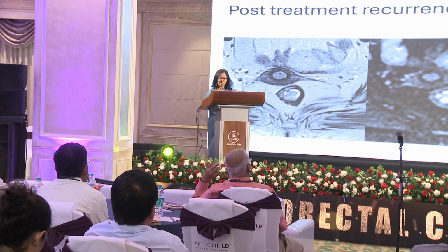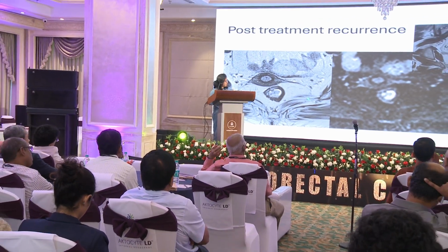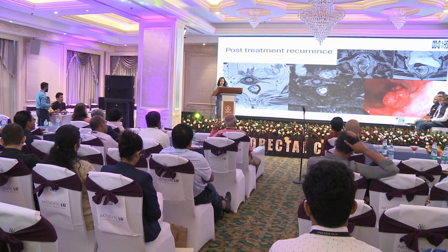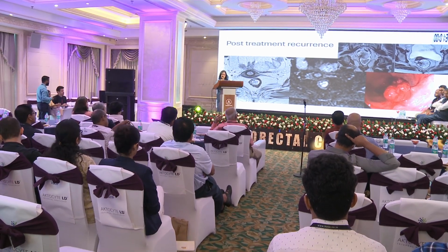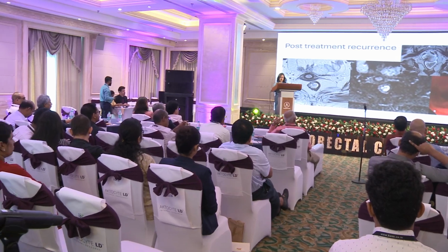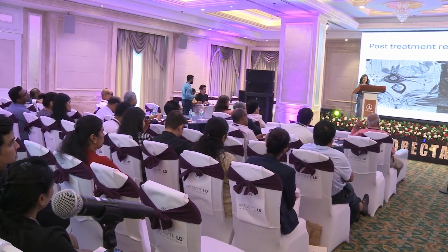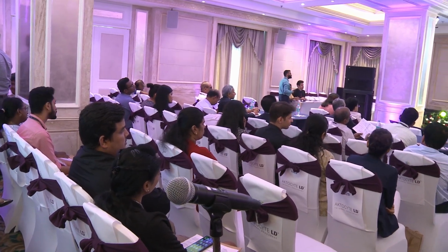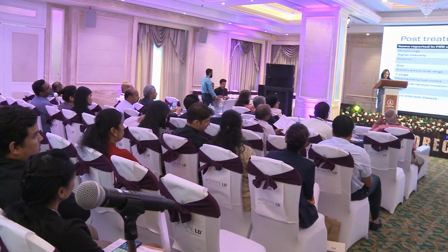So post-treatment recurrence is reported in a similar fashion. Identifying the invading margin, identifying the polyp attachment again is the key. And this is an example of a subpedunculated polyp that recurred after endoscopic mucosal resection.